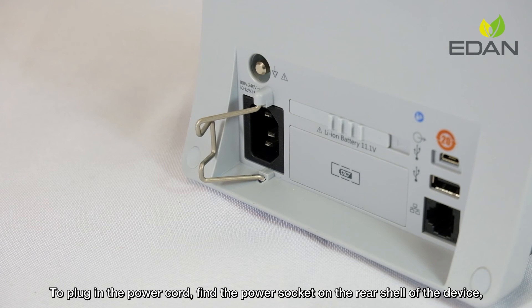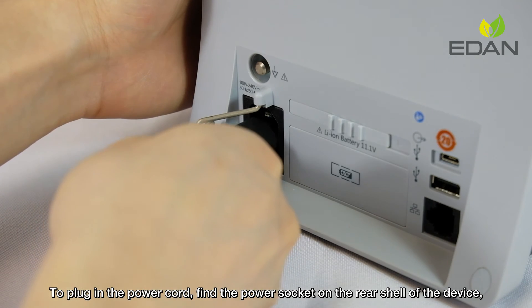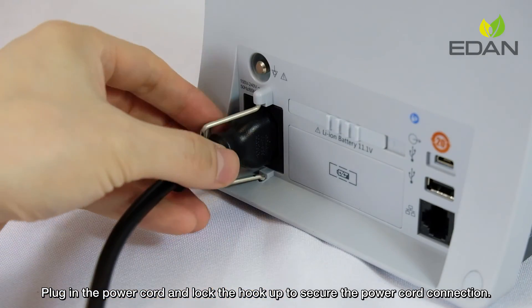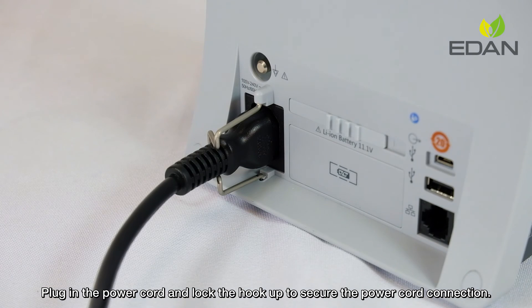To plug in the power cord, find the power socket on the rear side of the device. Plug in the power cord and lock the hook up to secure the power cord connection.